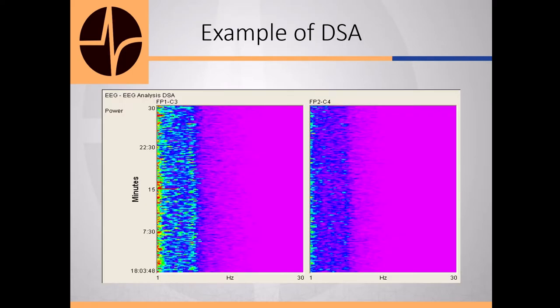He couldn't see this. It was just shades of gray to him. So exact same time, you can see there's a lot of stuff here about 7.5 hertz. And you've got this spike, you've got some outliers. You're always going to have outliers. That's why you need to be running your EEG as well.